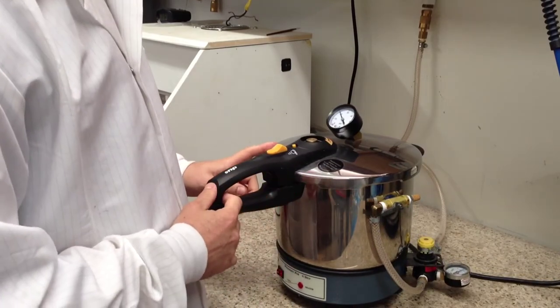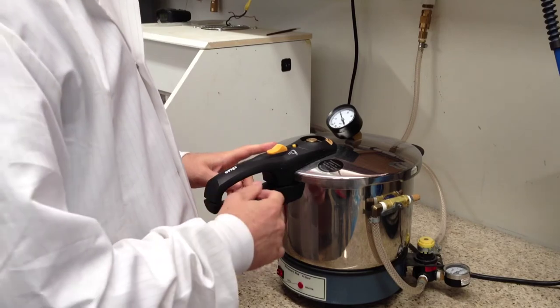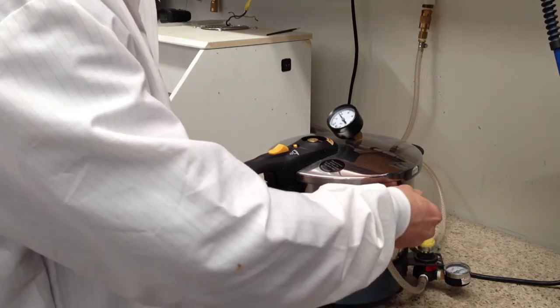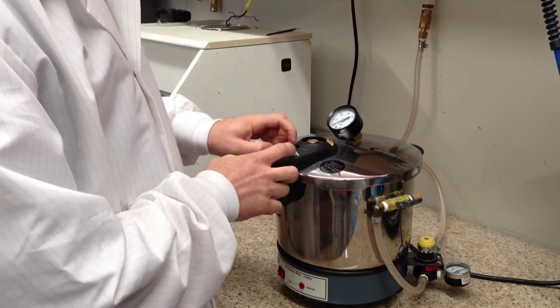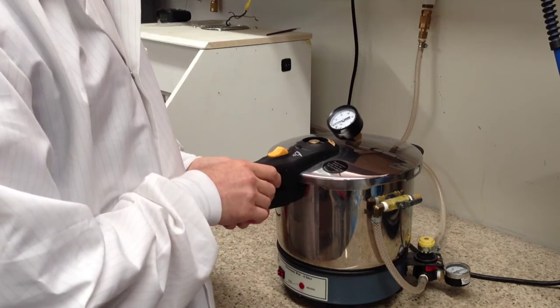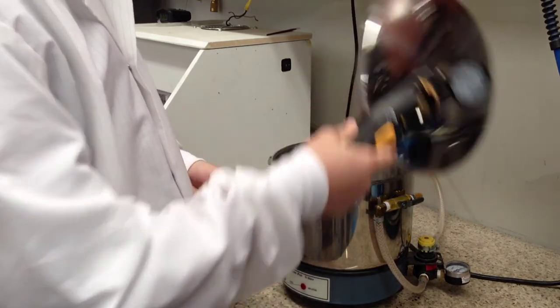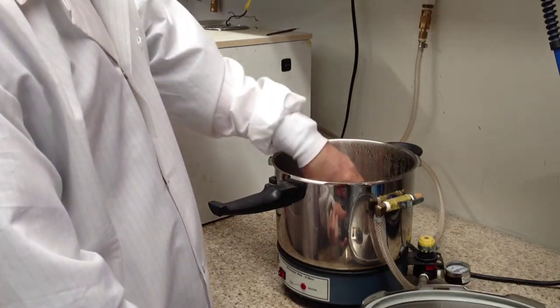Once you are finished curing after five to ten minutes, you will release the air, unlock your lid, open the pressure pot, and retrieve your model.